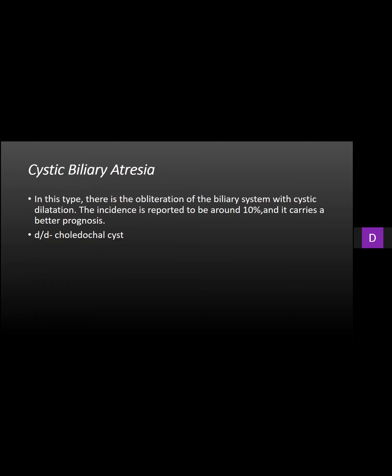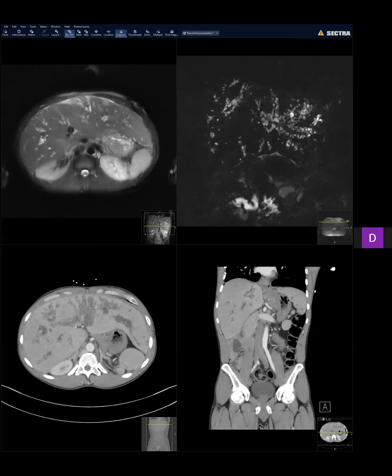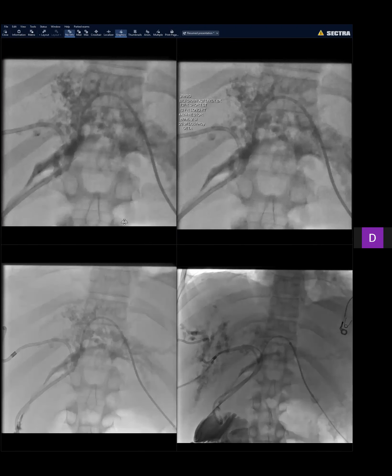This should not be confused with cystic biliary atresia, which is a variant where cyst formation occurs — more of a pediatric neonatal diagnosis where patients born with biliary atresia have a large cyst at the hilum. The debate is whether it's cystic biliary atresia versus choledochal cyst. This case is not cystic biliary atresia. The IR image confirms that the biliary system has micro-cysts formed within it.